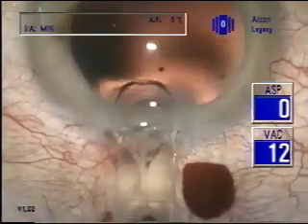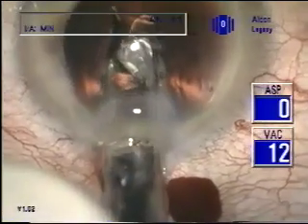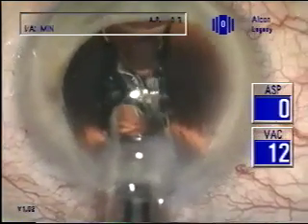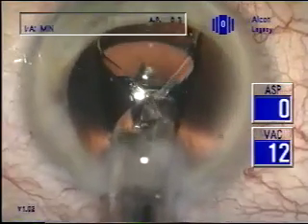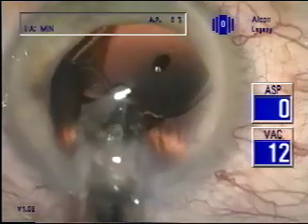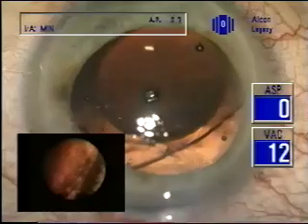In this case we are demonstrating the use of a plate haptic intraocular lens. It has been reported that with capsular bag contraction and tension on these lenses, after YAG laser capsulotomy they may be expressed into the vitreous. One would expect that the endocapsular ring will neutralize this contracting force and make these lenses safe in every situation.